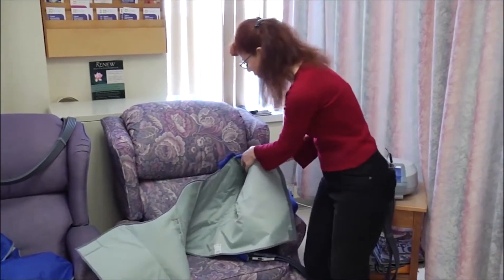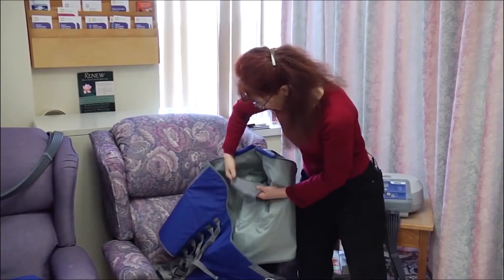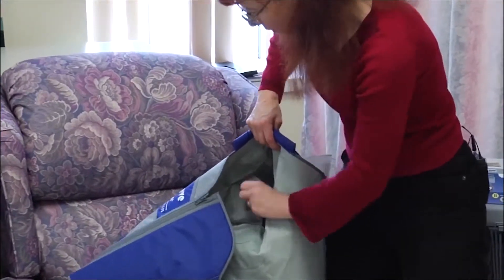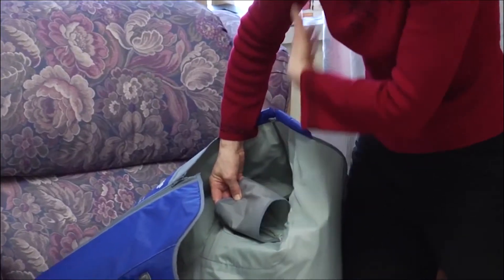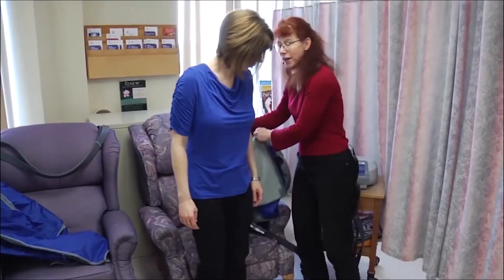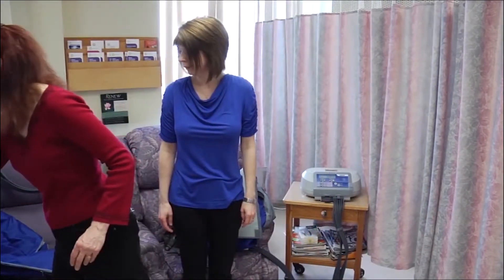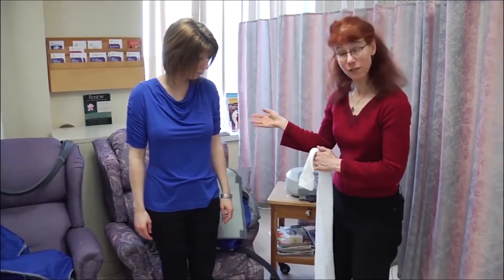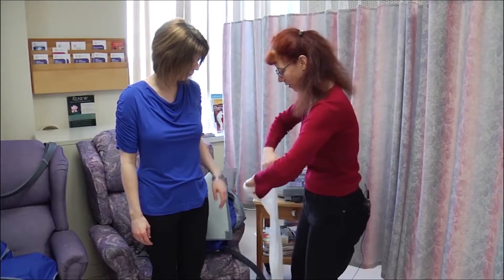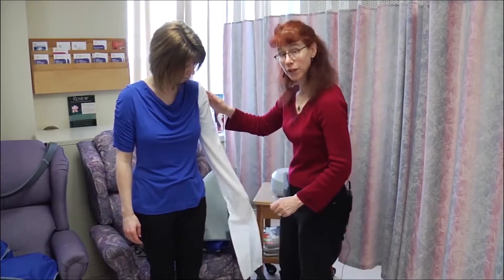Before having the patient put the jacket on, I'm going to take this chamber and make sure it's not folded in, because this is the chamber that's going to inflate up against the axilla and specifically help to clear that area. I'm also going to get a piece of stockinette since she's wearing short sleeves. Even though we sterilize the garment between uses, this way it's not making contact with her body, and it's more comfortable and more hygienic.